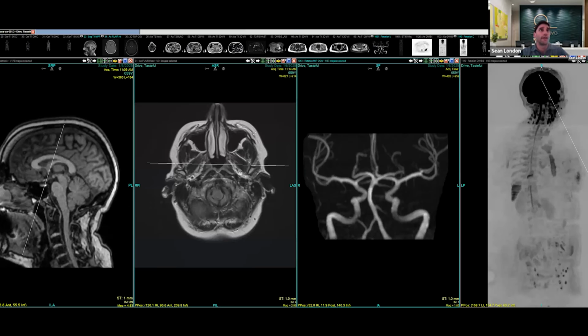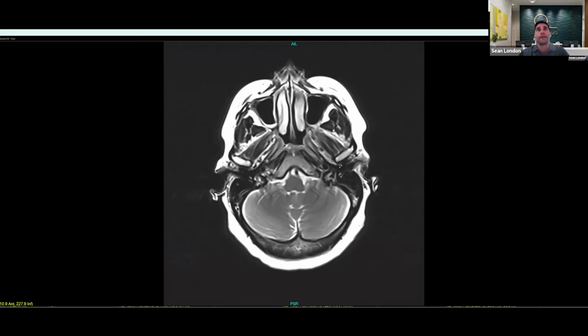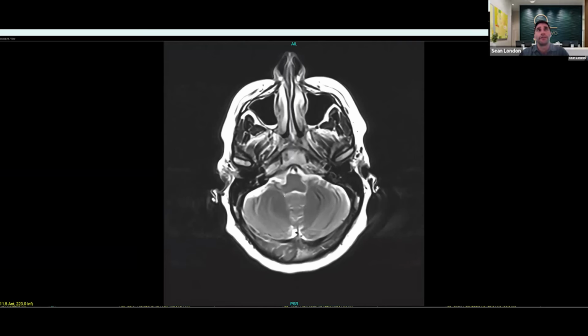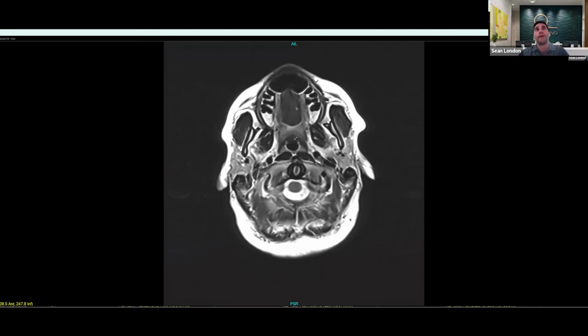The next thing I do is I go and look at the neck, and that is going to be on this set of images over here. So starting from the top, as I come down here, again, this is brain tissue. As I come further down, I look at all the major salivary glands. So we have paired structures by our ears called the parotid glands. So here's the left one right here by the left ear. Here's the right one by the right ear. And these look symmetric and normal, and I don't see any concerning masses in there.